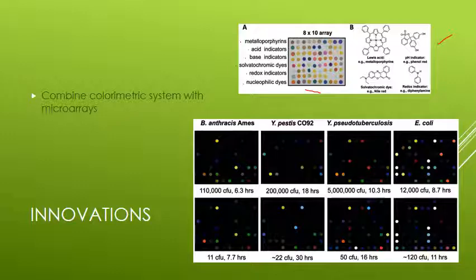Then as the organism grows, what we're measuring, if you look down here in this cartoon, is the rate of production of the various volatile acids in the number of hours.